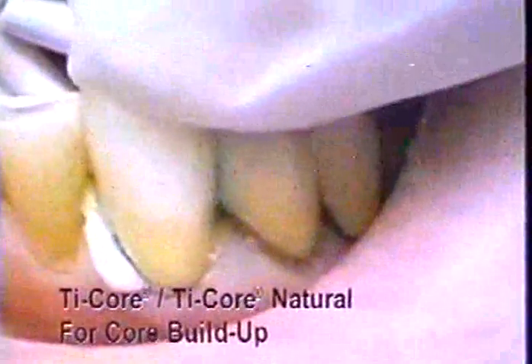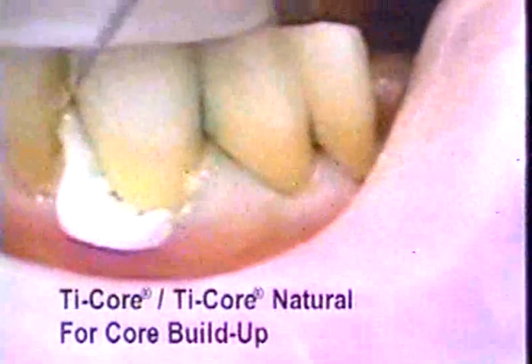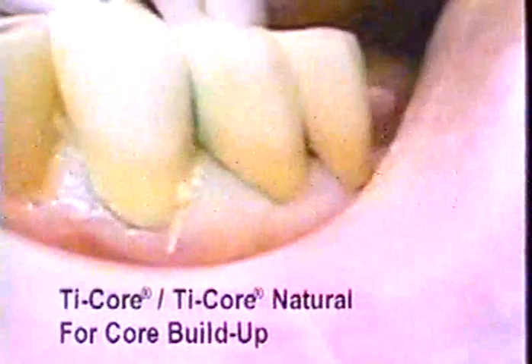Ti-Core, or Ti-Core Natural, a titanium and lanthanide metal reinforced core material, is syringed around the post and placed into the crown of the tooth. Here we see the bridge being seated and the excess Ti-Core Natural expressed around the margins. The excess Ti-Core Natural is easily removed with an explorer before the material has set.